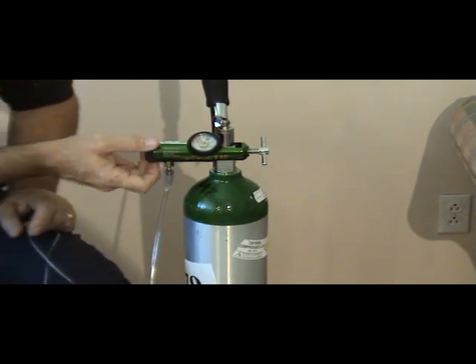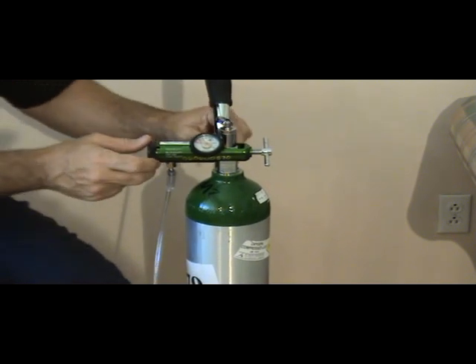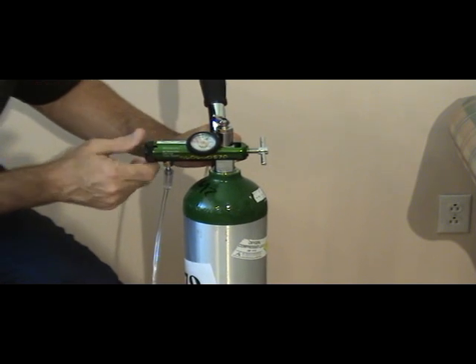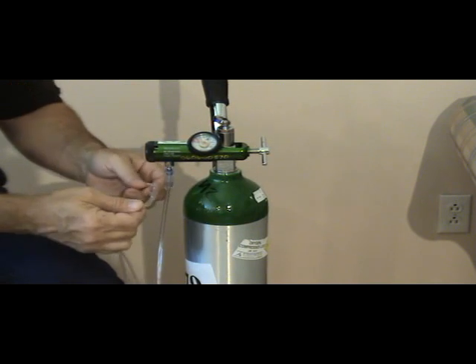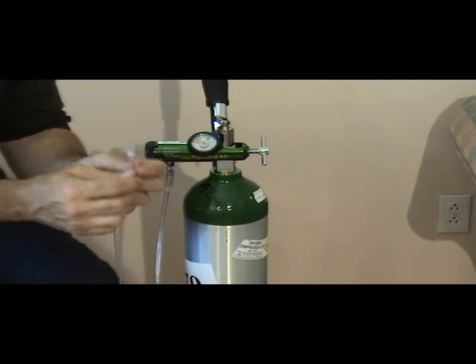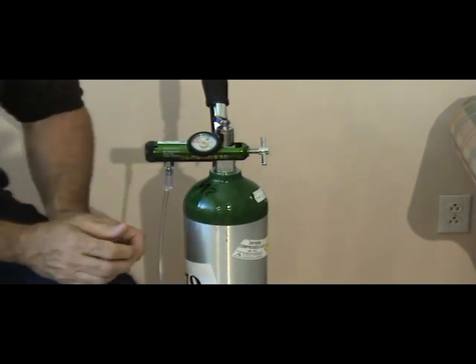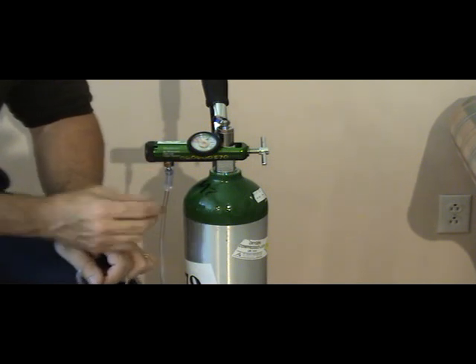So now we need to set this for the flow. We turn this knob to whatever flow we have set for the patient, which most of the time is 2 liters. So we're just going to turn this until we get to 2, and now we have flow going to the patient. So now all you have to do is place the nasal cannula on the face, or the mask, as you normally would.